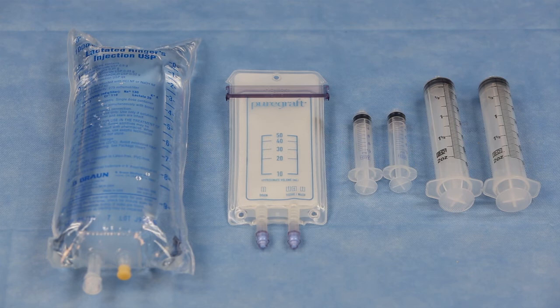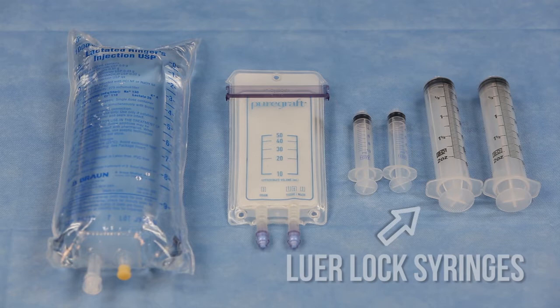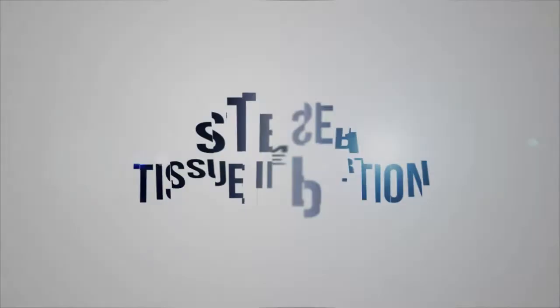Approximately 100 milliliters of lactated ringer solution will be needed to wash the tissue. A spiker and sterile bowl may be needed depending on the preferred washing technique. Luer-lock syringes will be needed for processing. Two 60 milliliter syringes for adding lactated ringers and draining waste are recommended, as well as at least two 10 milliliter or smaller syringes.